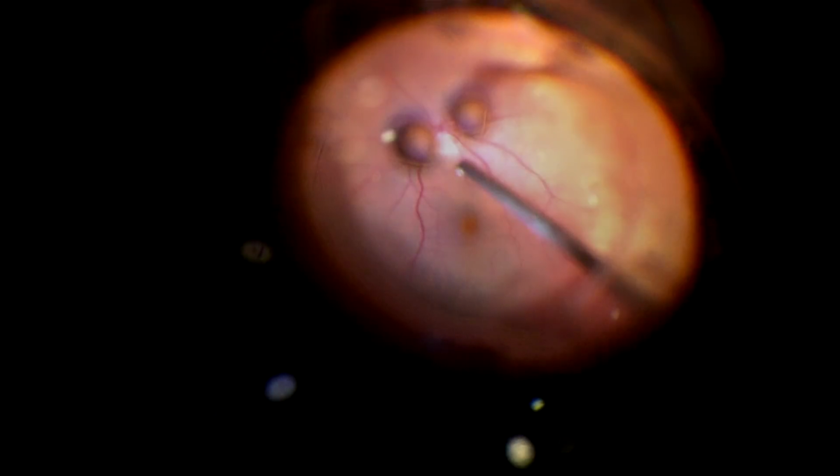And this posterior vitrectomy is edited quite a bit just to sort of highlight removing the vitreous and any of the lens material that's fallen posteriorly. And you can see how nicely this clears up. The vitrectomy is completed, and now we can see how much clearer the view of the fundus is.